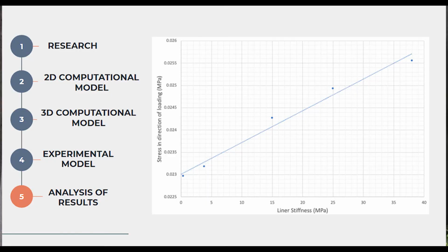This trend was also found when adjusting the socket stiffness, where a softer socket would result in less stress at the interface. However, this too sees practical limitations, particularly with excessive deformation of the socket. When varying the liner stiffness, again, a near-linear relationship is found. That is, with decreasing stiffness comes a decrease in peak stress. It is evident that the liner's effectiveness is limited by its thickness.